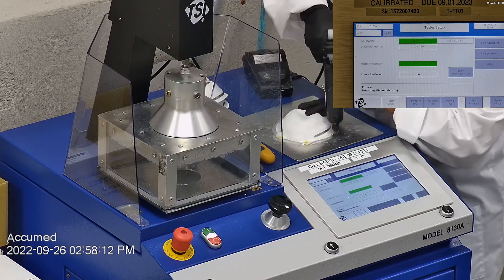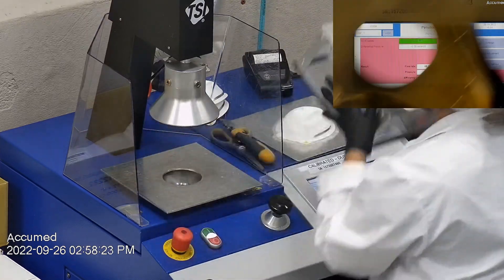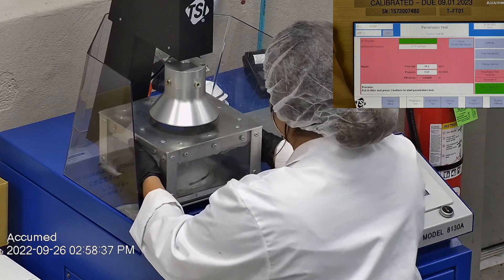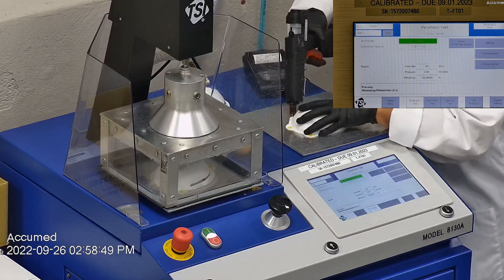The testing plate is attached to the frame and the box is placed under the TSI filter holder for testing. The results are displayed on the TSI monitor. F stands for air flow rate, which we test at 85 liters per minute. R is for resistance, also referred to as pressure drop — this correlates with breathability, so the lower the number, the more comfortable and breathable the mask is. E stands for filtration efficiency percentage.